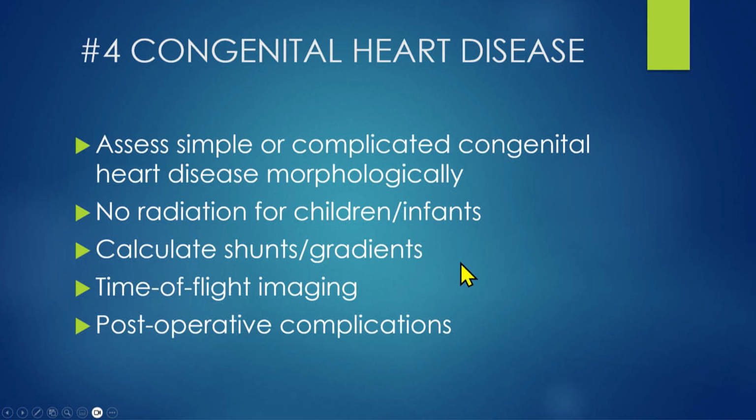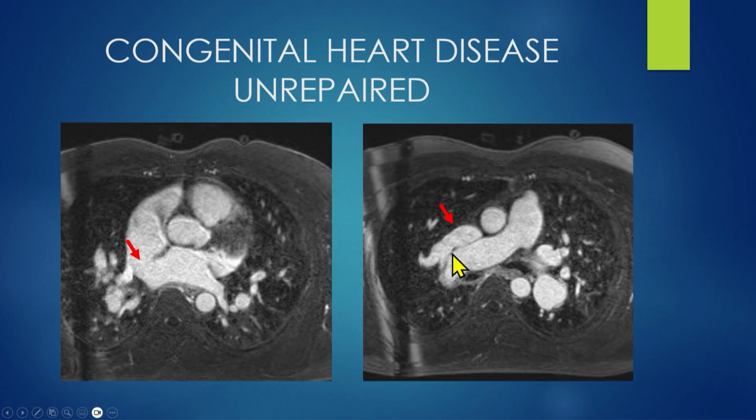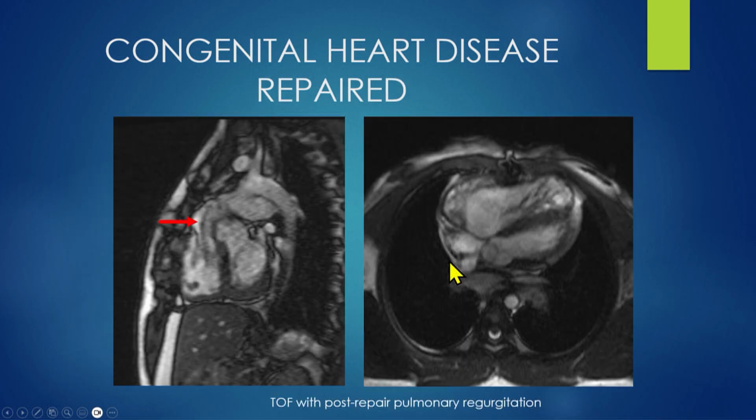because my discussion here underestimates how good this really is. It does many, many different things. Just to show a couple of examples, this is a sinus venosus ASD. We know that that is often correlated with partial anomalous pulmonary venous return of the right upper lobe, as shown here. Depicts it beautifully. Could you do a CT? Sure, but a lot of these patients are younger, radiation, blah, blah, blah. So the MRI is really useful. And in this case, you can do flow quantification as well, which you can't do on CT. A Qp/Qs shows the shunt fraction is nearly 3. That needs to be repaired.